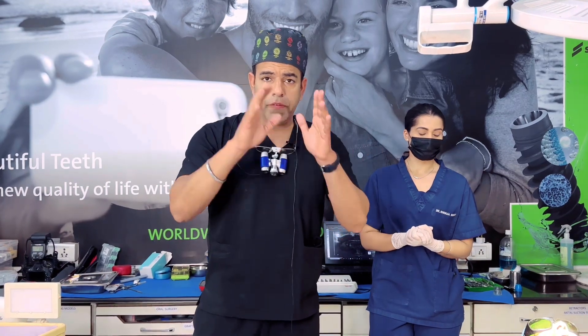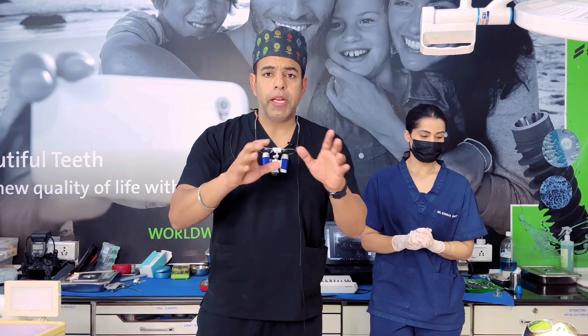We took around 20 minutes for this surgery. We did multi-unit implant placement with atraumatic extractions. We placed 4-5 implants and grafts along with the procedure.